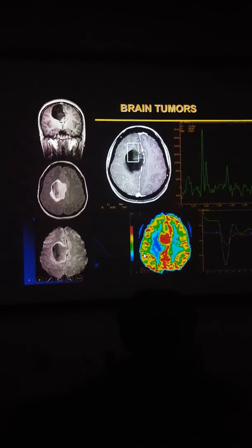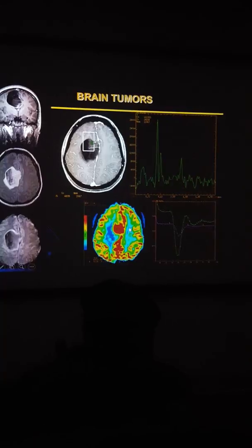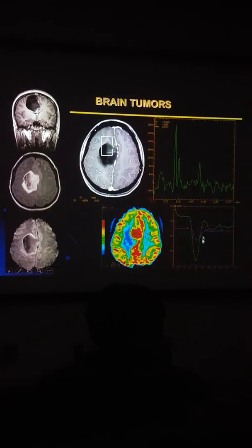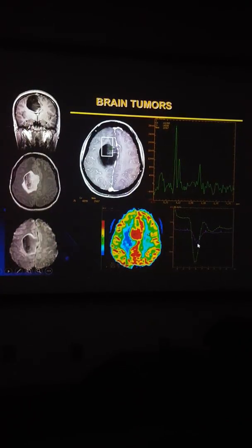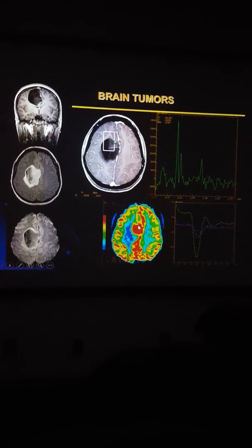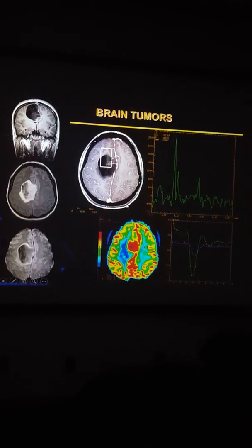Look at the MR perfusion, which we're going to be talking some more tomorrow. And this tumor has a very large capillary bed, which is represented by a relative cerebral blood volume that is very large compared to the normal tissue, which is this one here. So the normal tissue is referenced from the contralateral cerebral hemisphere at the same location that we are sampling on the affected side. Okay. So this is functional information.